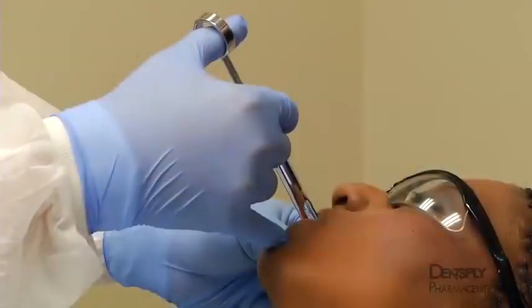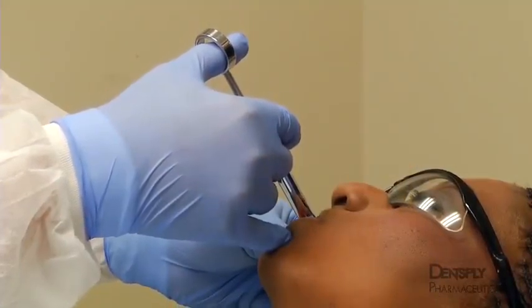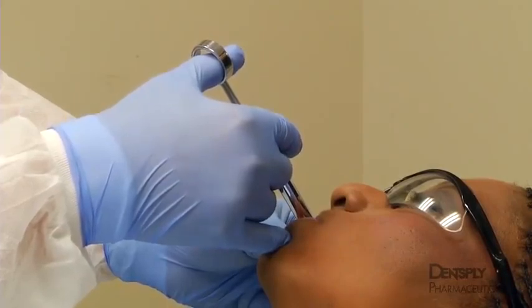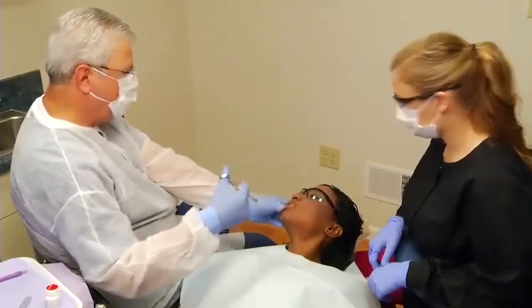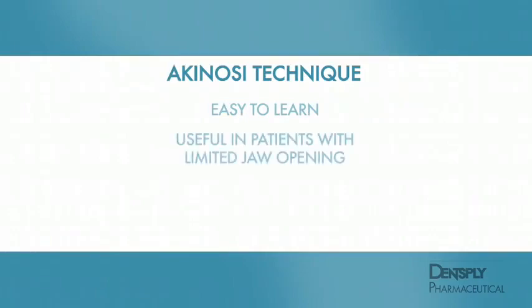As the needle is slowly advanced to its ultimate depth of 2.5 centimeters, a few drops of anesthetic can be administered to reduce discomfort during insertion. After a negative aspiration is obtained, the entire cartridge is slowly injected. Although the closed mouth technique is essentially a blind injection, it is technically easy to learn and of great advantage in the patient with limited jaw opening.